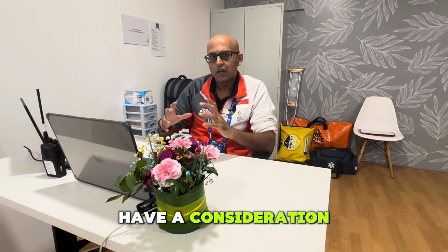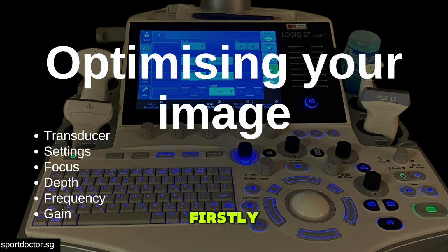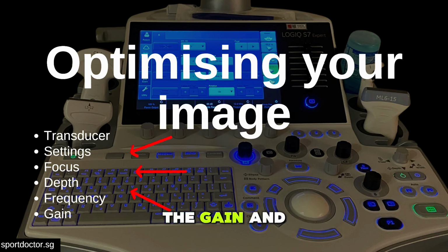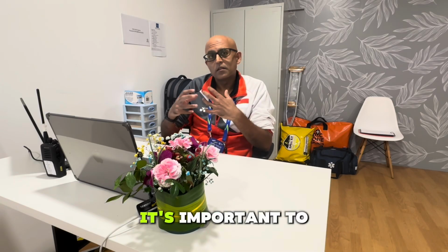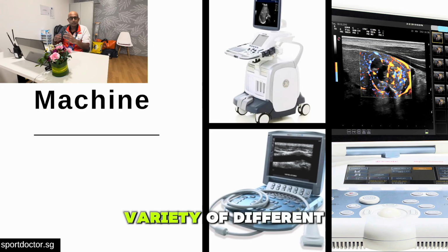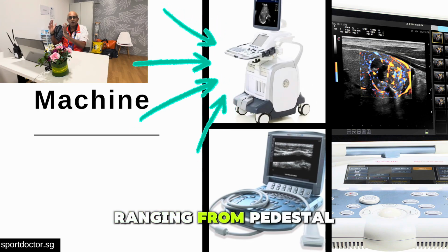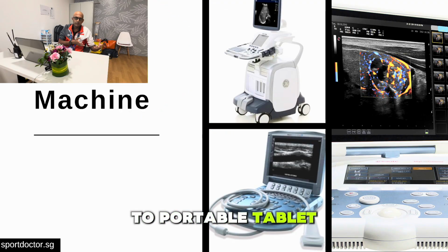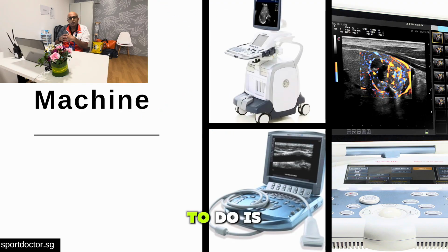So to optimize your image, you need to have a consideration of various things. Firstly, the transducer, the settings of the transducer, the frequency, the aperture, the gain, and the depth. When considering ultrasound as well, it's important to have a think about the machine that you're going to be using. There's a whole variety of different models, ranging from pedestal models with many different functions to portable tablet versions. What you need to do is understand what purpose you're going to be using it for.